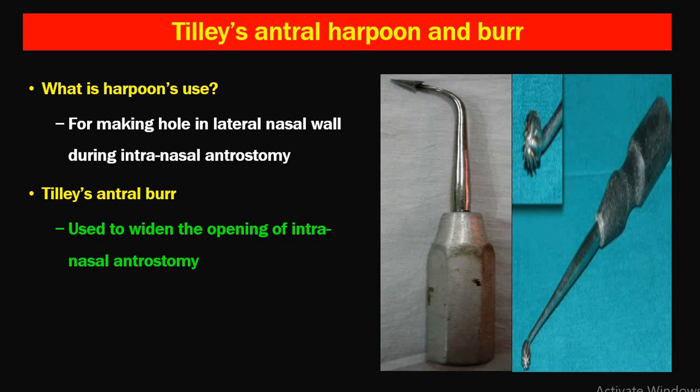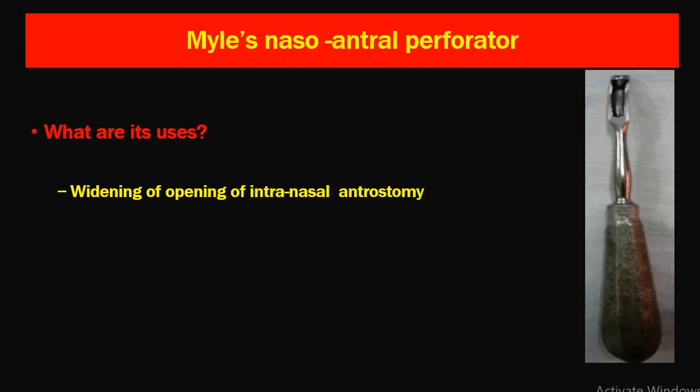The next instruments are Tilly's antrum harpoon and antrum bar. These are rarely used nowadays as intranasal antrostomy is seldom performed. The harpoon is used for making a hole in the lateral nasal wall during intranasal antrostomy. The antrum bar is used to widen the opening of the intranasal antrostomy or to make the opening smooth. The last instrument discussed is Myles' nasoantral perforator, used for widening the opening of the intranasal antrostomy in cases of antral surgery, which is also rarely performed nowadays.